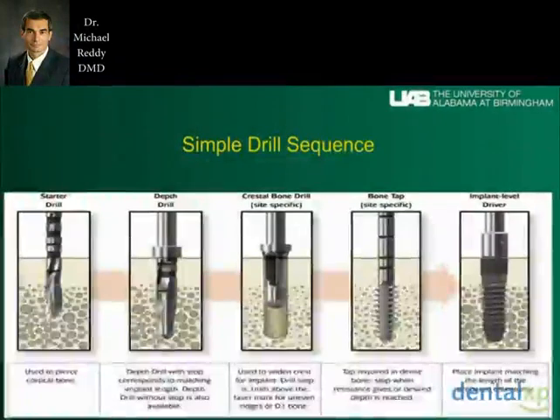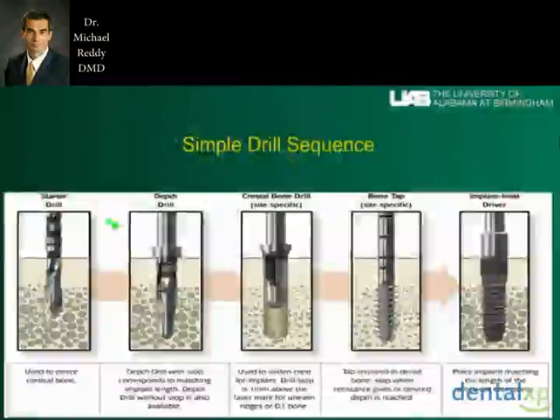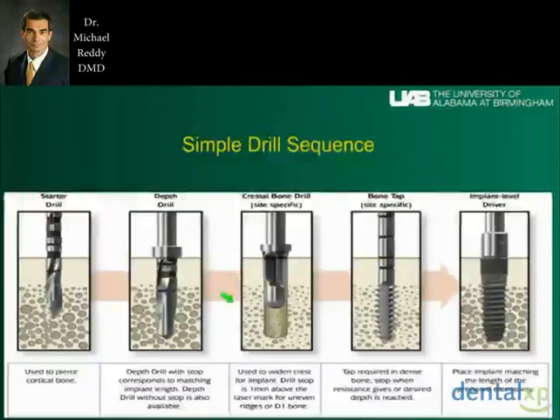Again, this is a simple drilling sequence like we looked at a little bit earlier, starting with a 2mm starter drill to go through the cortical plate, then the 2mm depth drill. There's a crestal bone drill to go ahead and use this.